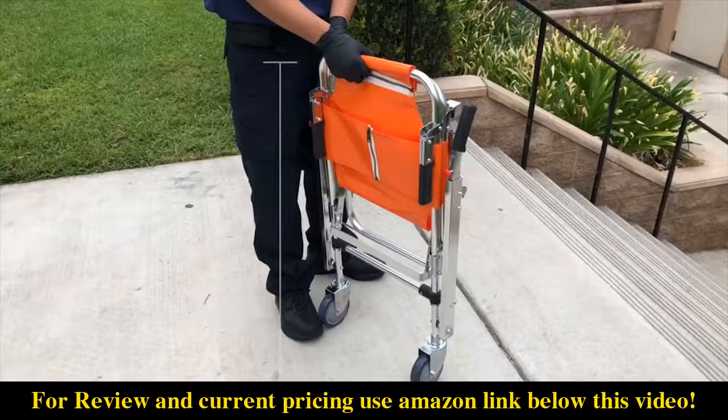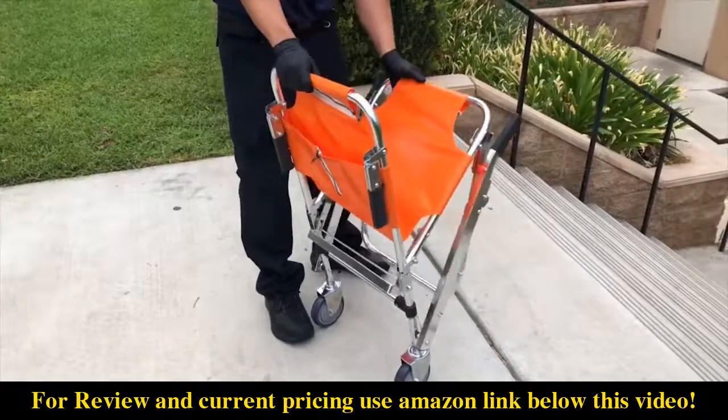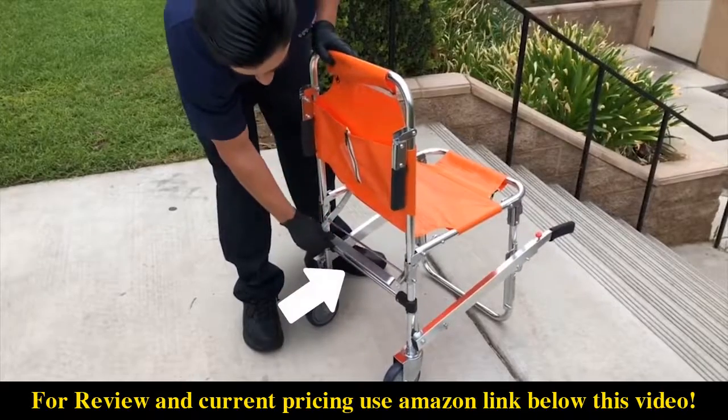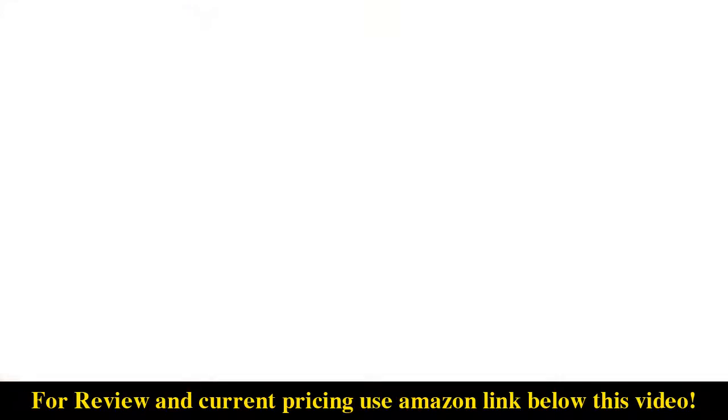To unfold, stand at the side of the chair and position the chair on its wheels in a vertical position. Grasp the frame at the seat and back, then briskly push them away from each other until the chair locks into place. Confirm the chair is locked by visually checking that both sides of the lock bar are engaged.